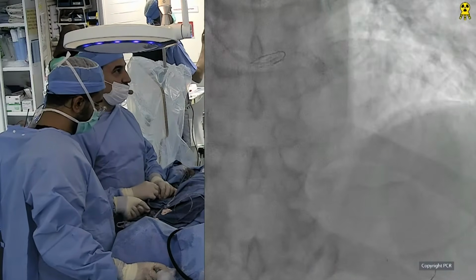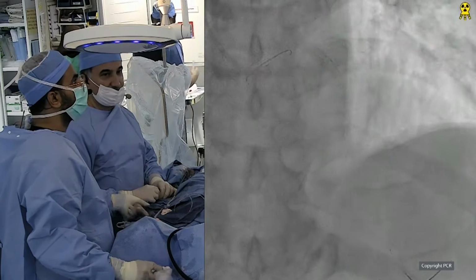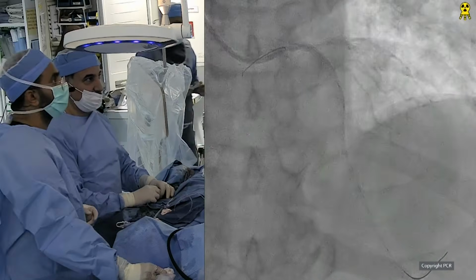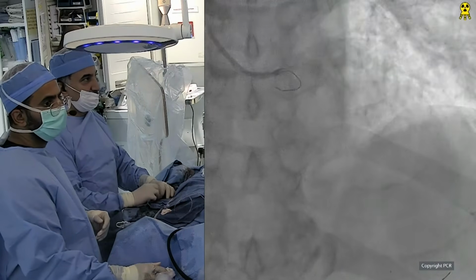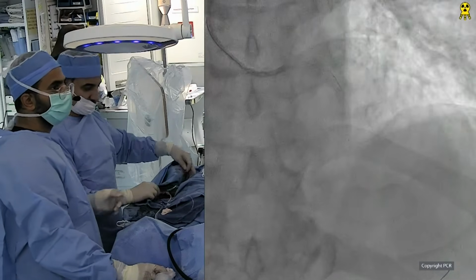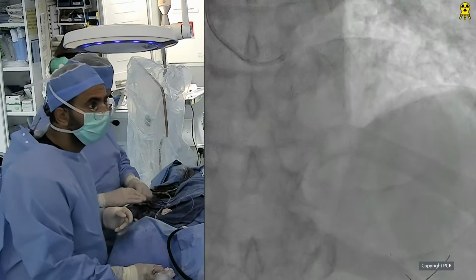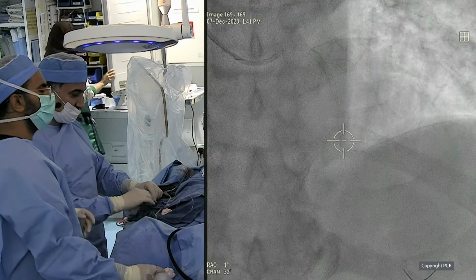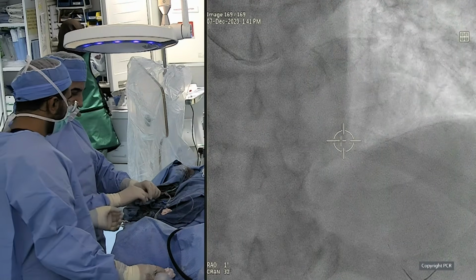The majority here in the room actually thinks you've already done a fantastic job. There is TIMI 3 flow, no ischemia, no pain, and only a moderate nick at the ostium of that diagonal, if any. Most of us would leave that alone now.